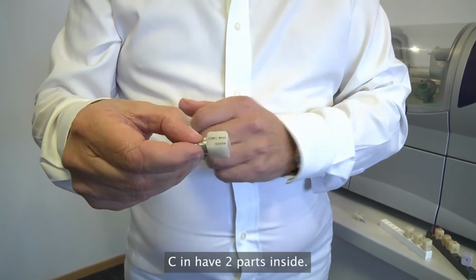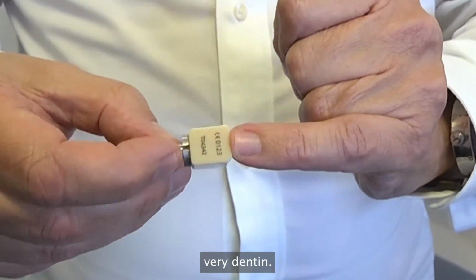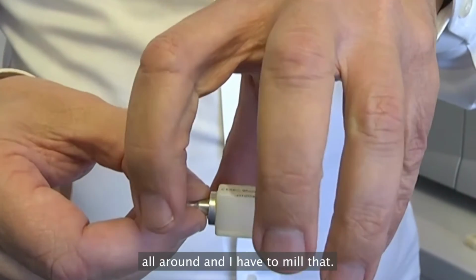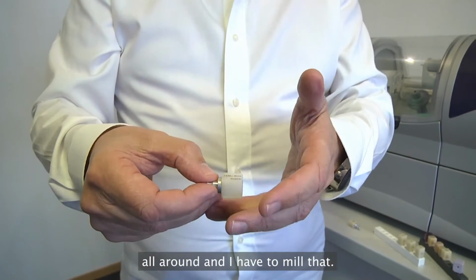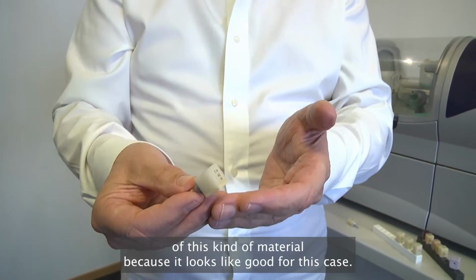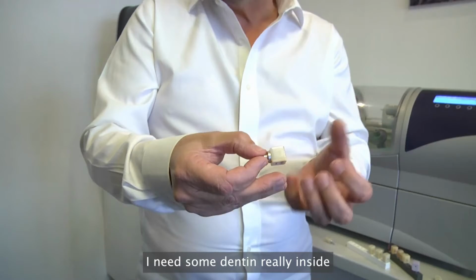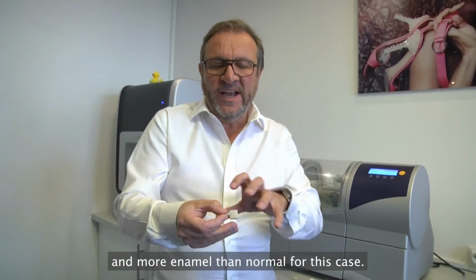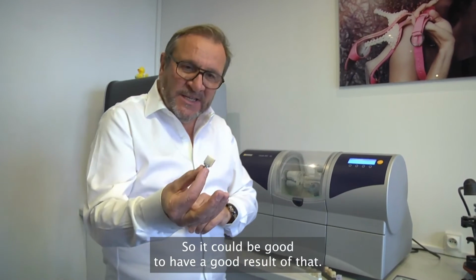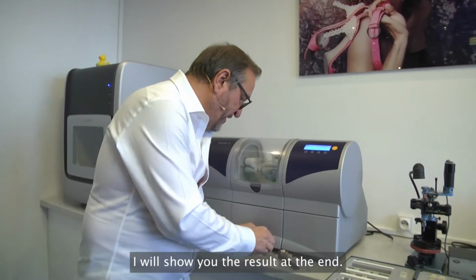It has two parts inside. We have a spheric part, very dentin. You see, this area is inside, and enamel all around. And I have to mill that. I have made some samples. I'll show you the effect of this kind of material, because it looked good for this case. I need some dentin really inside, and more enamel than normal for this case. So it could be good to have a good result with that. I'll show you the result at the end.